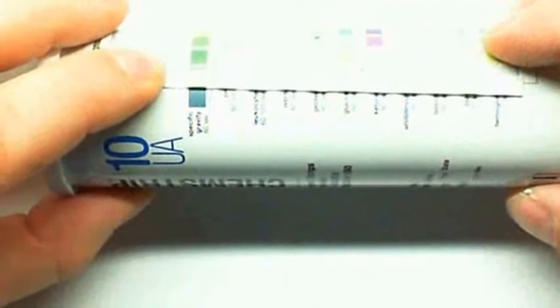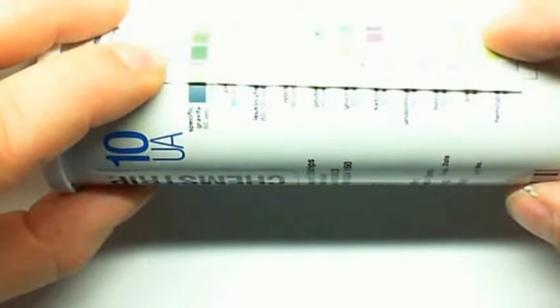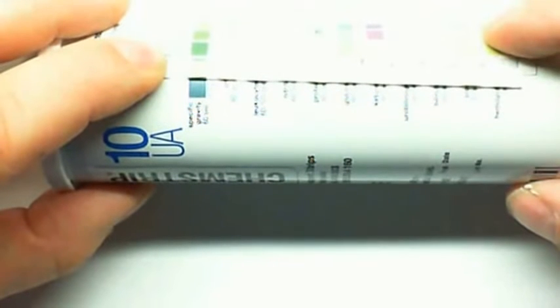So let's talk about the first one, specific gravity. Specific gravity is essentially how concentrated the urine is. If water has a specific gravity of about 1, then as you add things to it like electrolytes or urea, the specific gravity goes up. So specific gravity is essentially a measure of how many electrolytes and how much urea is dissolved in the water of the urine. Higher specific gravities mean a more concentrated urine, lower specific gravities mean a more dilute urine.